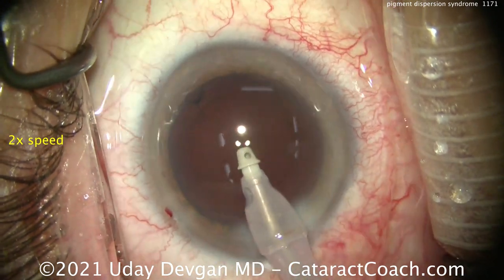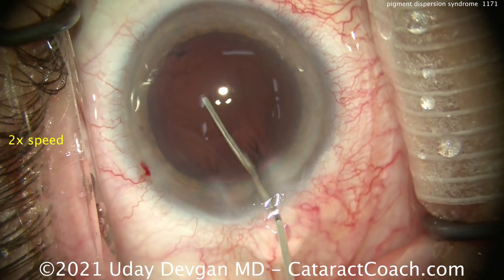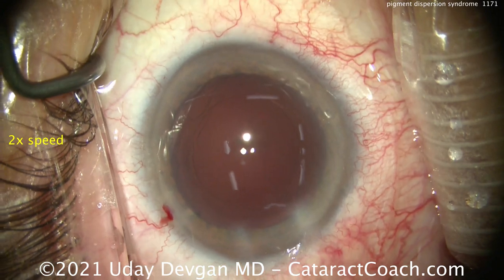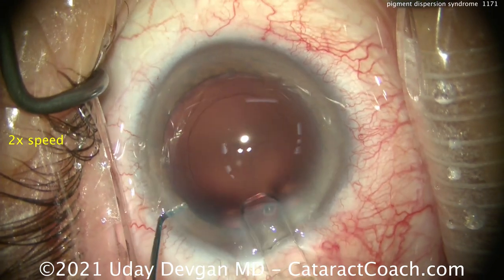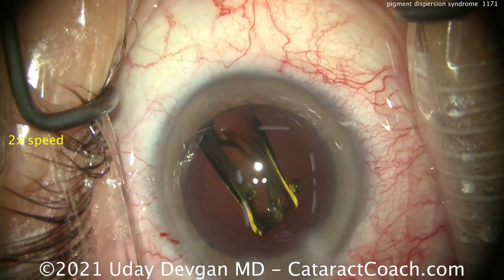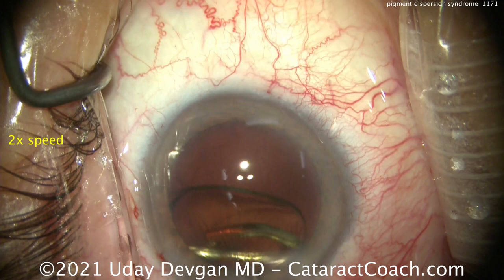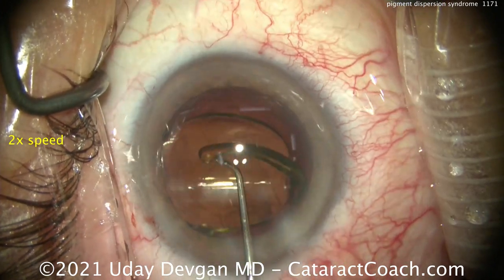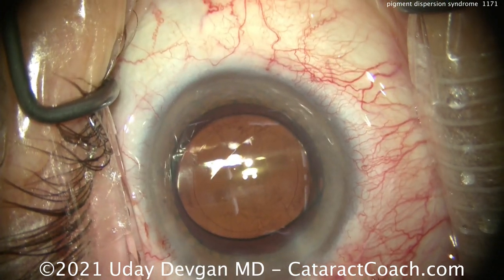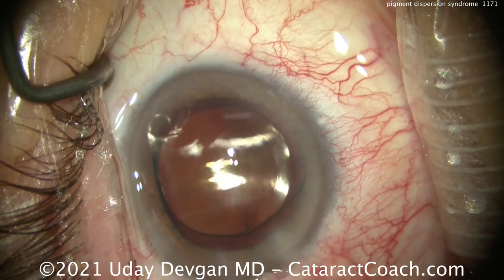Cleaning up the capsular bag here — the nucleus and cortex are already out. This looks pretty clean with a nice-looking rhexis. Now, importantly in patients with pigment dispersion syndrome, please get the IOL in the capsular bag. You don't want to put a sulcus lens in these patients as they're going to have even more pigment dispersion. Luckily, we're putting in a beautiful lens right in the capsular bag.